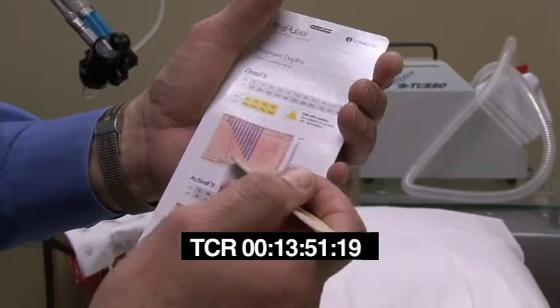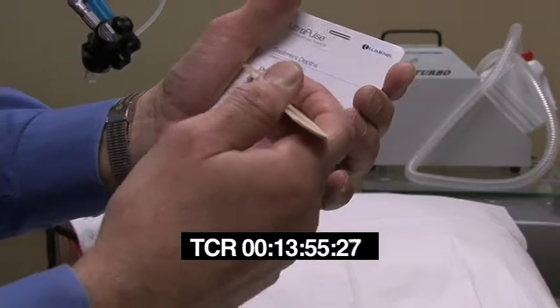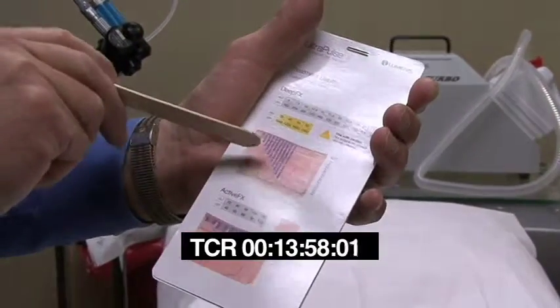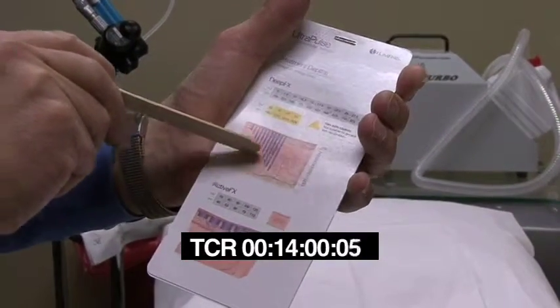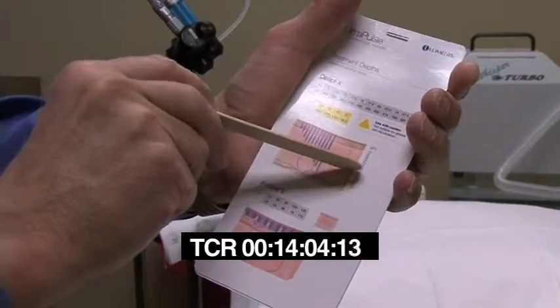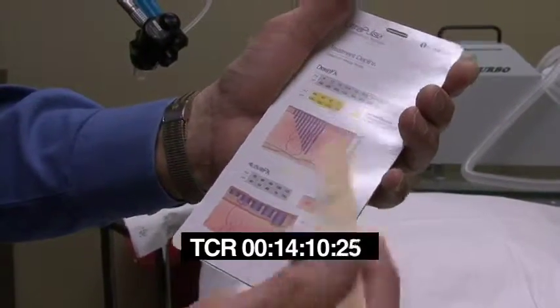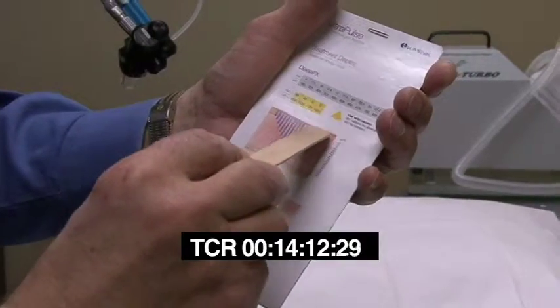We don't want to penetrate that deep because we can promote scarring. What we want to do is set the deep FX settings so that we penetrate to about this layer here. So this allows us to get beneath most of the scar areas and beneath most of the deep wrinkles. We follow the deep FX with the active FX. The active FX, this is a blow-up of this portion of the skin.